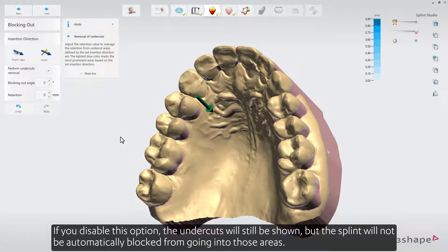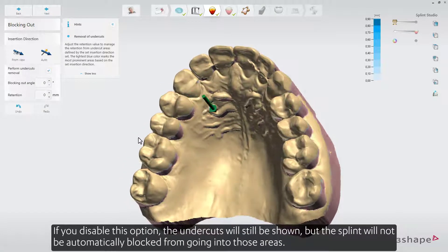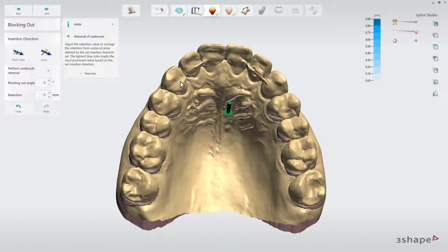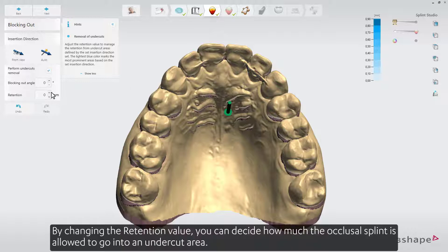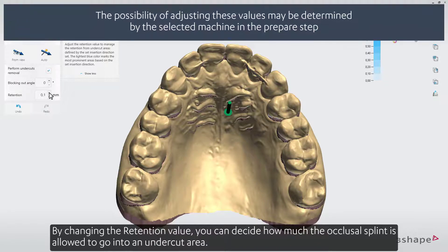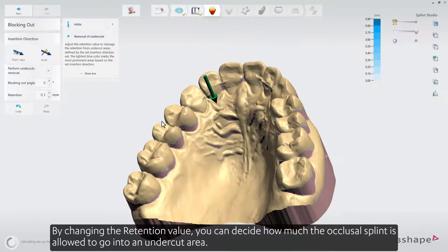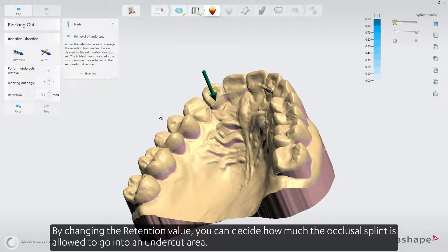If you disable this option, the undercuts will still be shown, but the splint will not be automatically blocked from going into those areas. By changing the retention value, you can decide how much the occlusal splint is allowed to go into an undercut area.